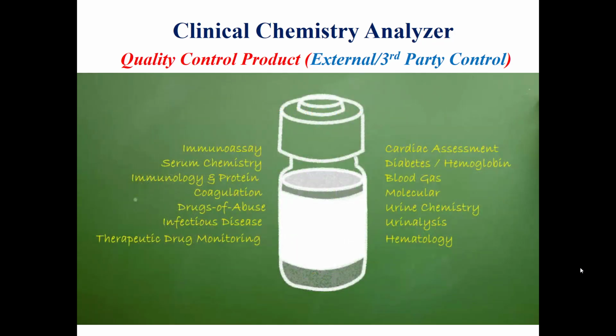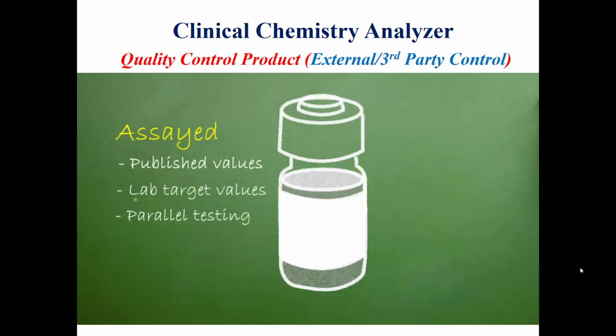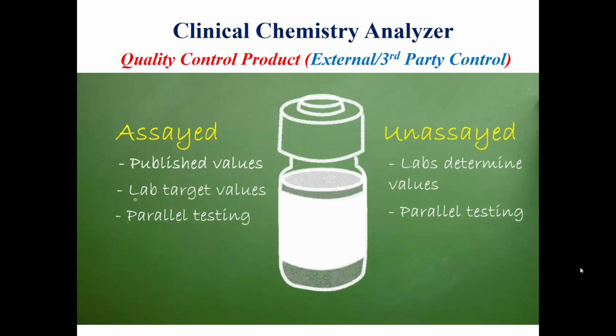Control manufacturers produce many types of controls. Some controls are assayed, meaning that the values are published for all instruments. Assayed controls only give the lab initial target values. They must determine their own values by performing parallel testing on their new and old lots. Unassayed means that the values are not published.